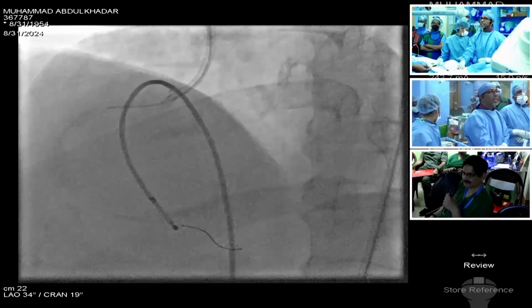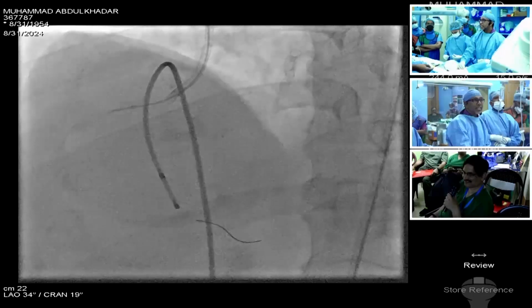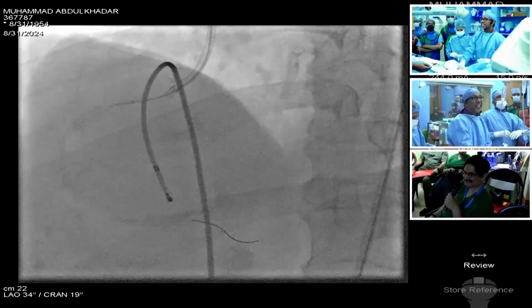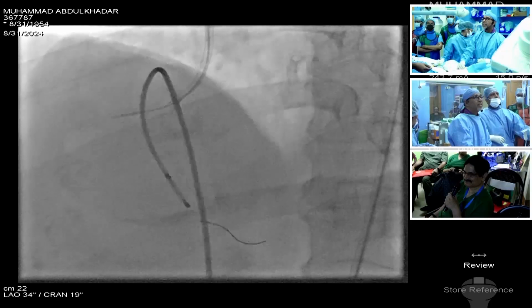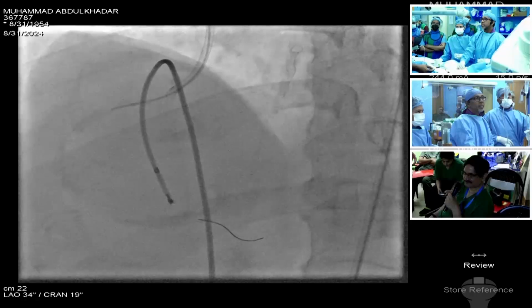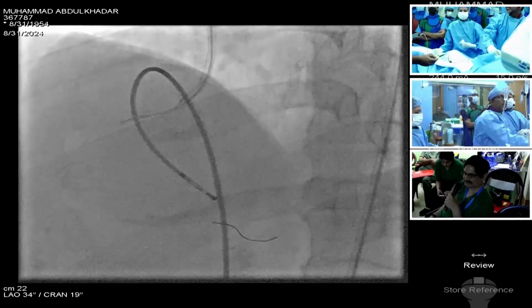As Dr. Kaparthi had mentioned initially, you'll be more happy doing this case with a Judkins catheter, but then at the end of the procedure, tracking the stent might be difficult. So that's the spacing, right? Check the pace. Okay, I'll just push it in.